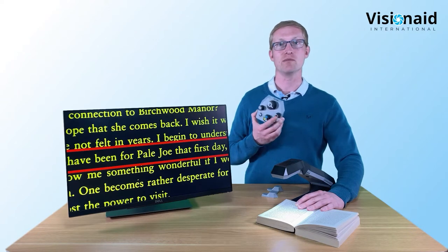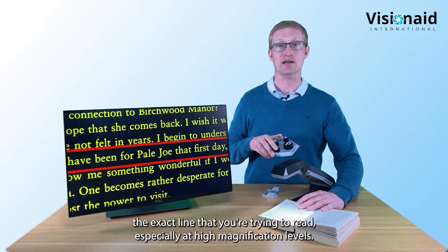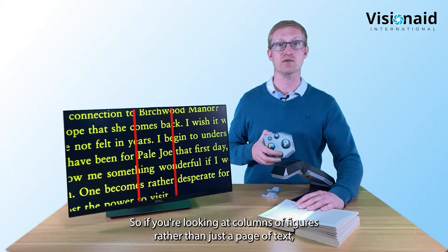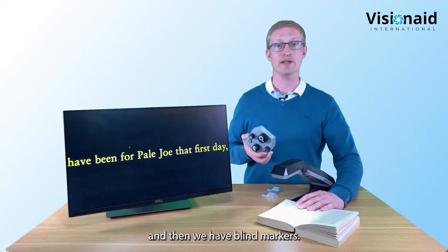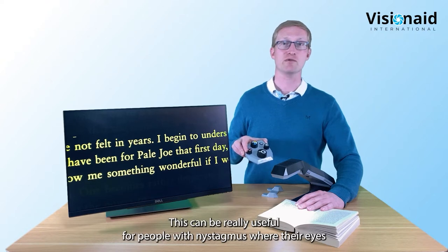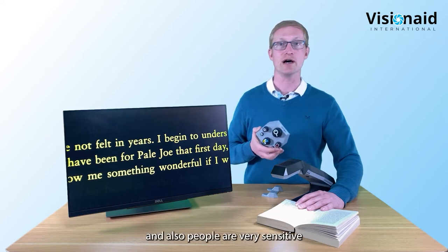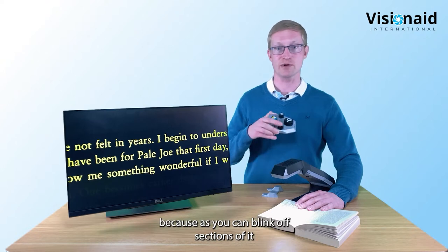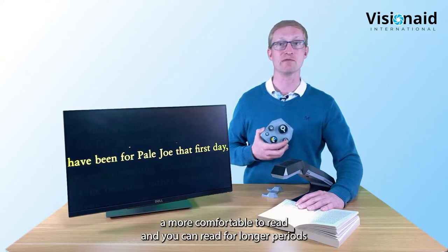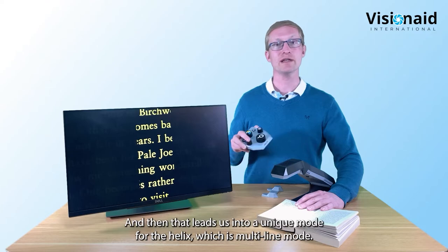The line markers help you stay on the exact line you're trying to read, which can be tricky especially at higher magnification levels. There are also vertical line markers for looking at columns of figures. Blind markers work on the same idea but mask off an area of the screen - really useful for people with nystagmus or those sensitive to light, as you can blank off sections and stay focused on a single line, making reading more comfortable and enjoyable.